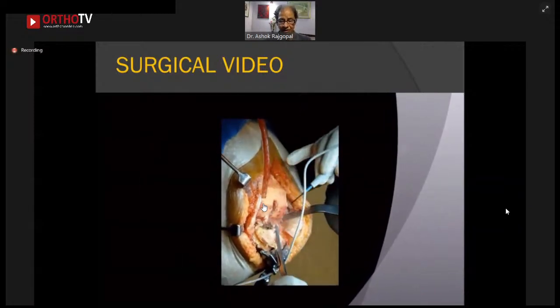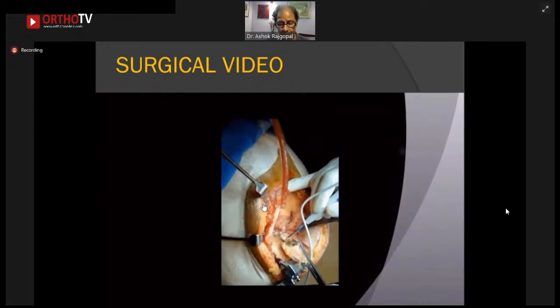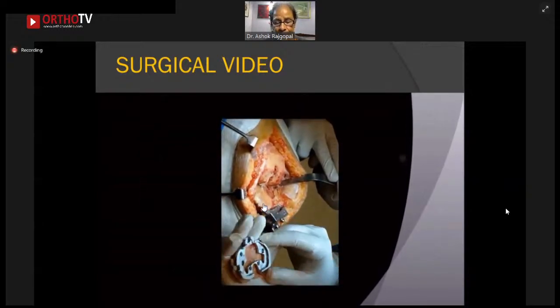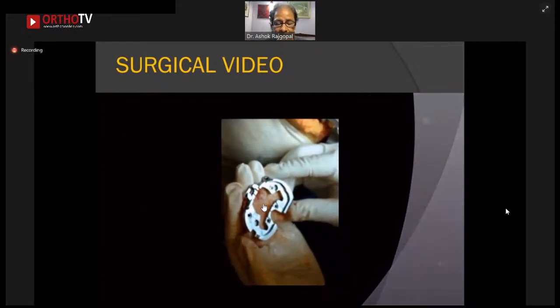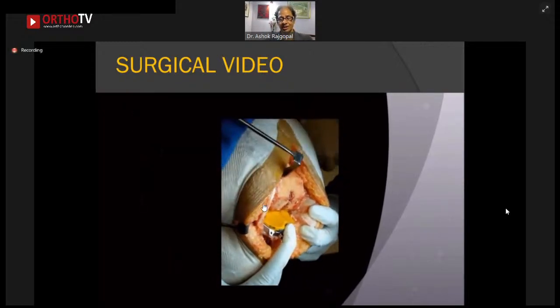So that pretty much is your resections all done. A lot of people ask me, do you not balance your knee? Do you not check for the balance in flexion and extension? I think that's a great point. So this is the way we size our tibia. Rather than putting it on the cut surface, we put it on the resected surface. It gives us a very good index. And this is how we balance our knee.